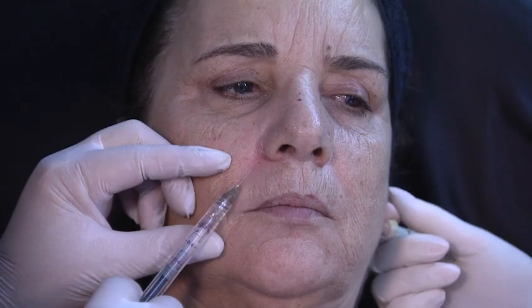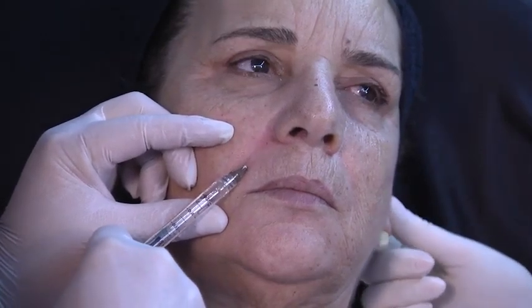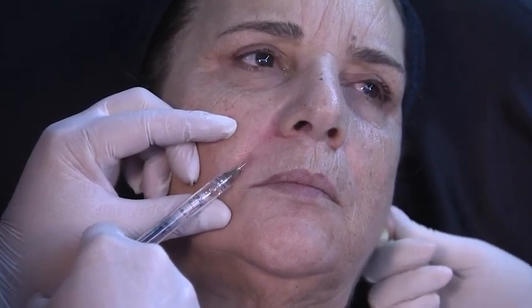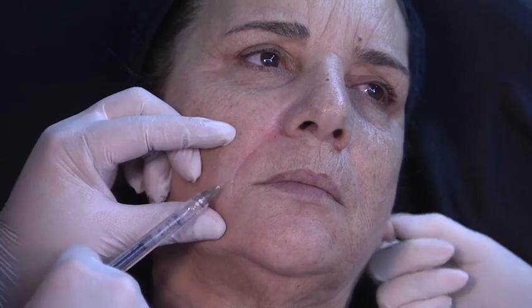Because I am going to continue with the treatment of the nasolabial fold. I am going to go with my needle pointing medial, because if I go in the nasolabial fold itself, part of my product is going to go up here. So I need my product to go to this area, so I'm going to go a little bit more medial. And here, I am parallel to the skin, okay? And look, I am in deep dermis. I can see the shape of my needle, but not the transparency of my needle. So I will infiltrate, linear threading, classical thing that we were doing 15 years ago.